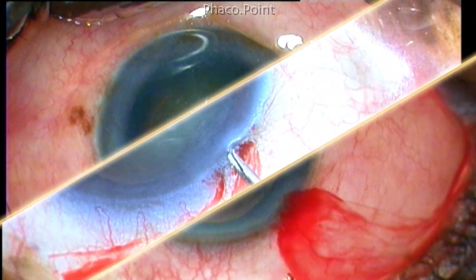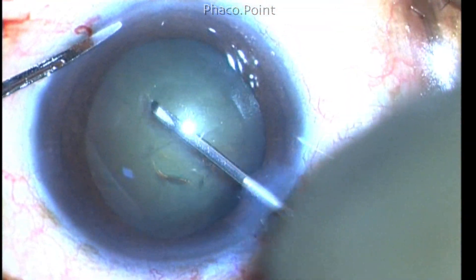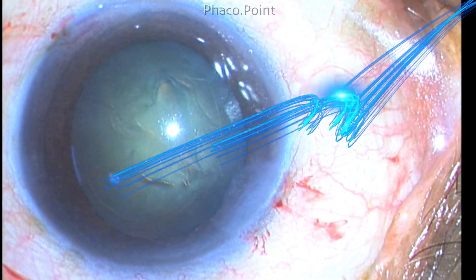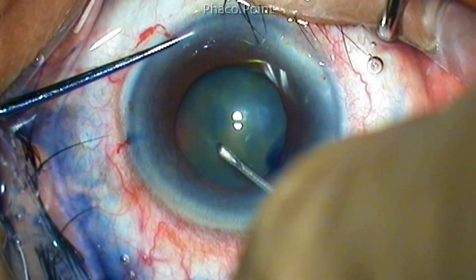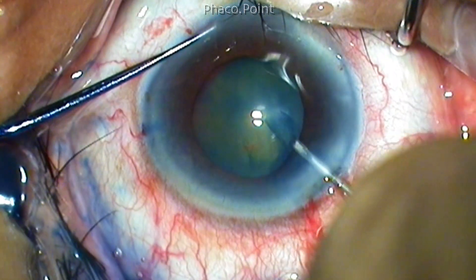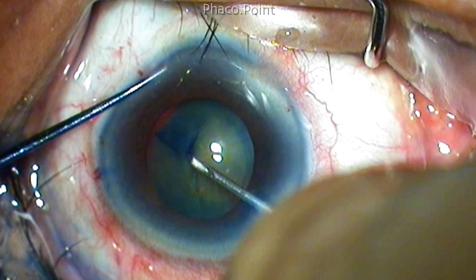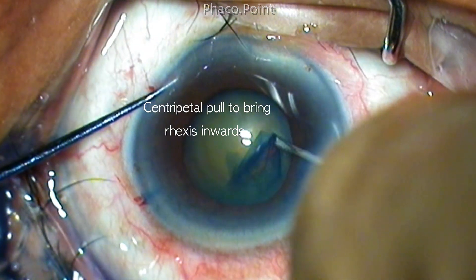Let's take another look at the tangential pull force in action. This looks very elegant — there is a lot of control in the direction of the capsulorhexis. The chamber needs to be well formed while performing this; in a shallow chamber, the rhexis tends to run outwards. We also need to re-grasp the tearing capsule multiple times to maintain good control of the tearing edge. A centripetal pull can also help to bring the rhexis from outwards in.